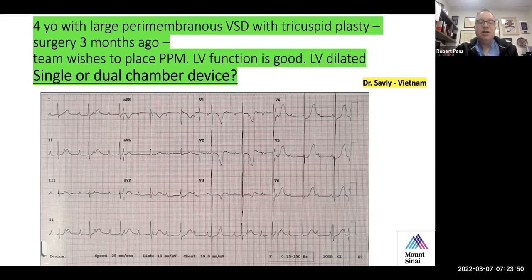Probably at his next change out, I will change it, because the other thing that happens as you age, of course, is your heart stiffens and your end diastolic pressure rises, so the impact of dual chamber pacing on your cardiac output is enhanced. So the bottom line is there isn't really a right answer about single versus dual chamber. To some degree, it matters how good the surgeon is at placing these leads. And then the other issue is whether it's really necessary. I am generally a minimalist when it comes to these types of things.